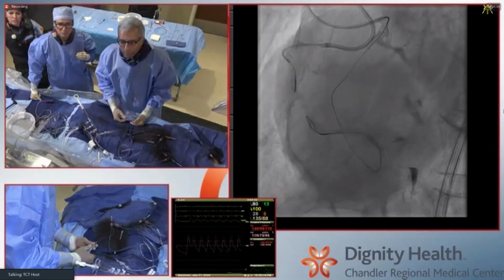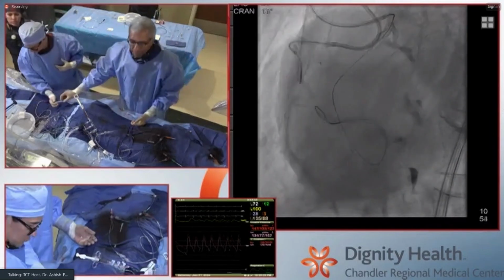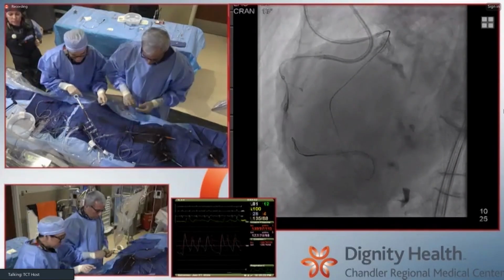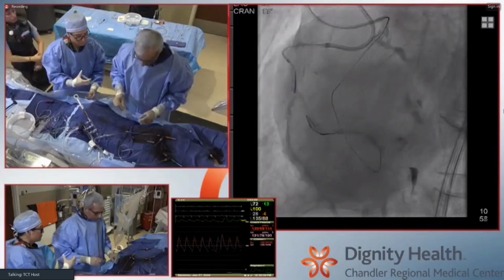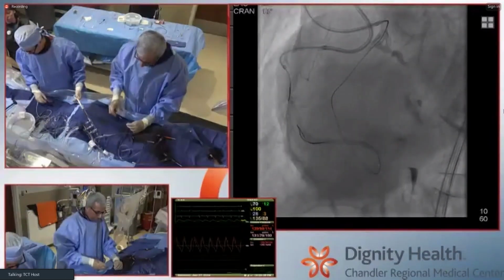Yeah, so it's a wall. I think you're right at the proximal cap. I think the easiest point to enter this is going to be a little bit back from where your tip is. Yep, I'm going to back out a little bit and then, just because it's concrete, not keep banging against that front door.